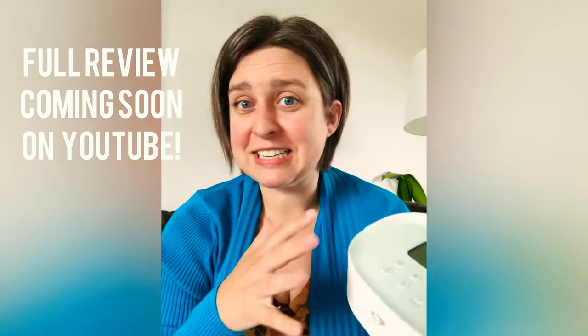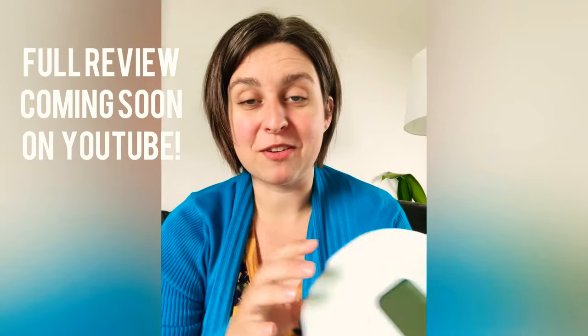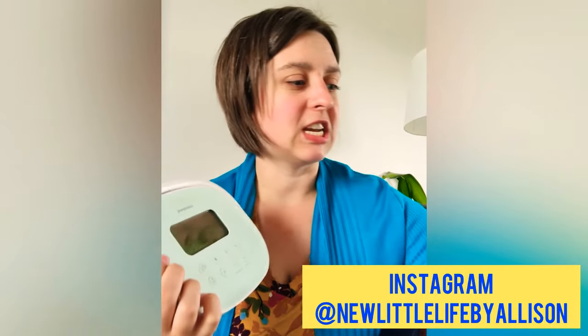I just got some Pumpable pumps in the mail and it's gonna be a couple weeks before I can get a full review with all the details out to you on YouTube, so I'll give you a little preview here on Instagram. First we're gonna do the bigger one which is the Super Genie, and then I will do another one on the Genie Advanced.